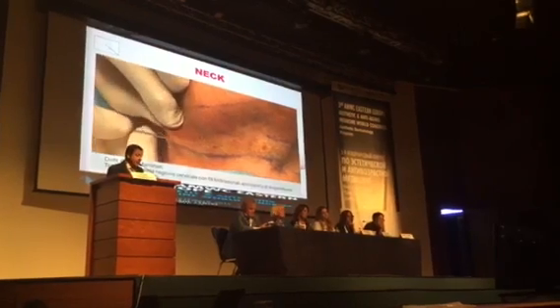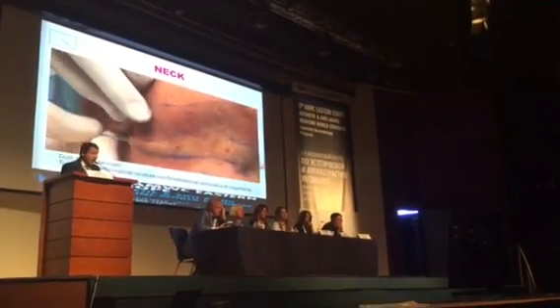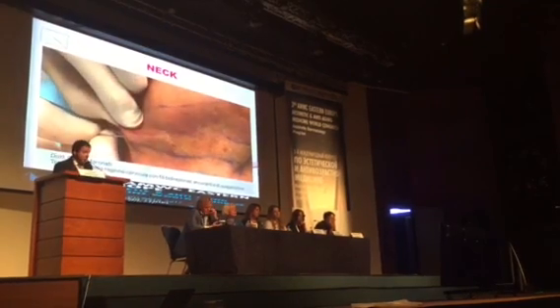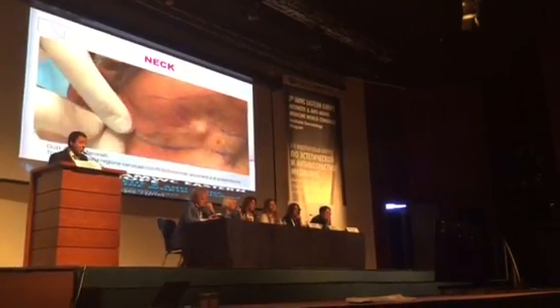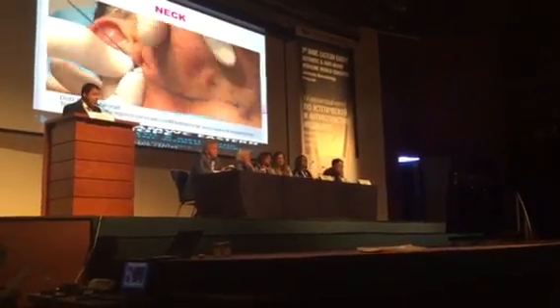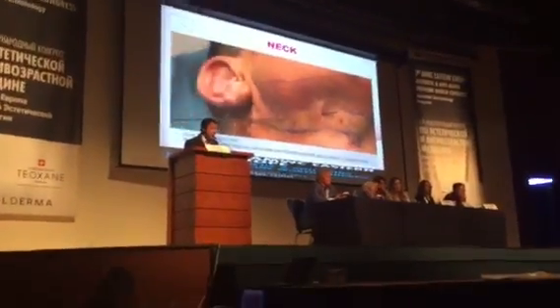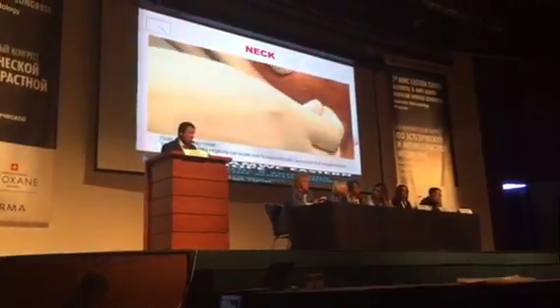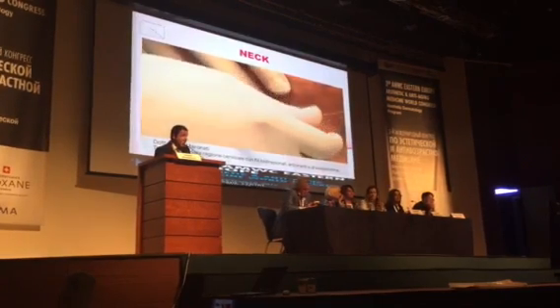Then I separate my needle and I go forward. This movement that I show is to know that we are in the right position, in the right plane. Because if not, we can have a problem. We don't have to go too superficial or too deep. Then I exit with my needle.